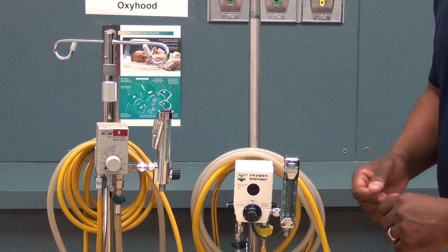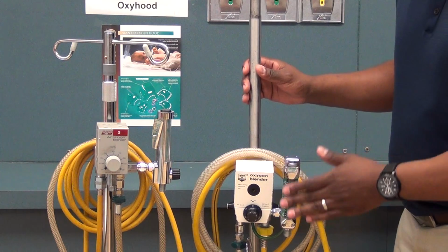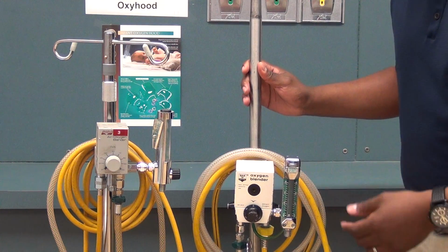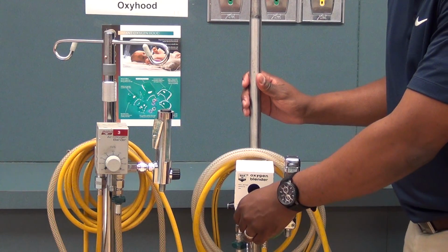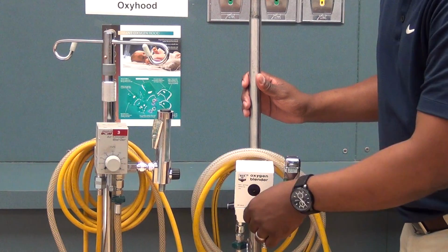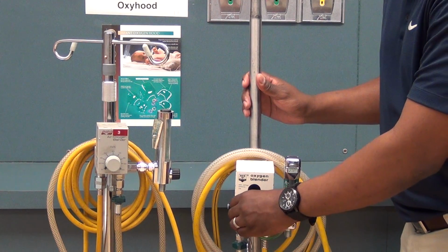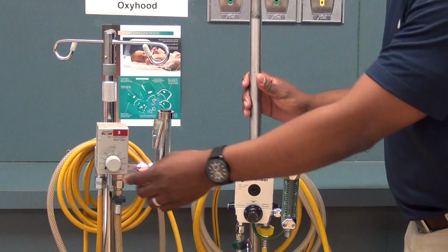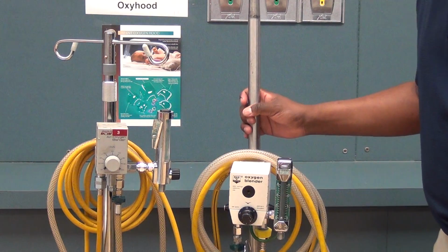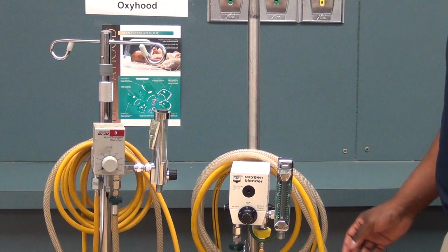The way that these blenders work, we have a flow meter that's attached, which we will give our liter flow, but to control the FiO2, we will actually adjust the dial. The dial on both of these blenders goes from 21% all the way to 100% with various stopping points in between. So that is how we're able to give a direct FiO2.